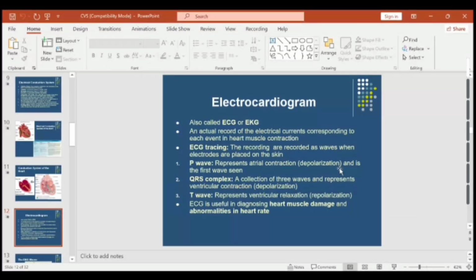It involves placing sensors, which we call electrodes, across your body, and they pick up those impulses, which are simply electrical signals generated from your heart and transmitted into the rest of your body via electrolytes. We know electrolytes are good conductors of electricity, and much of your extracellular fluid is made up of electrolytes. These impulses are very weak, so they have to be amplified into something readable.